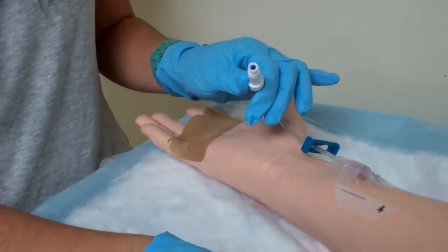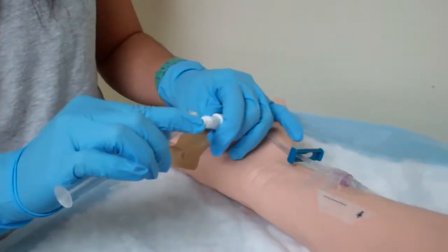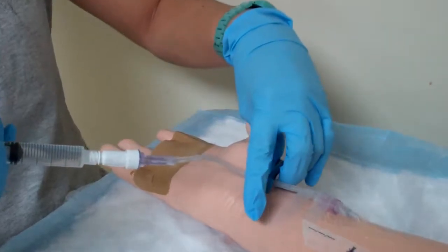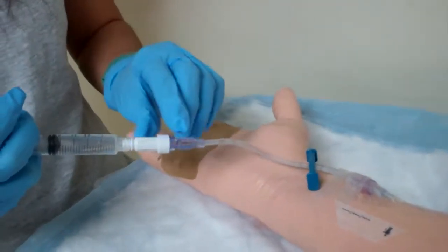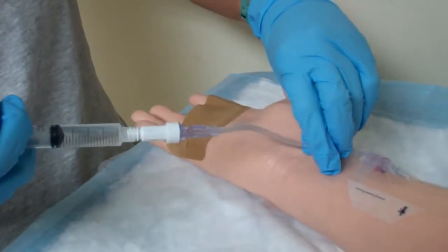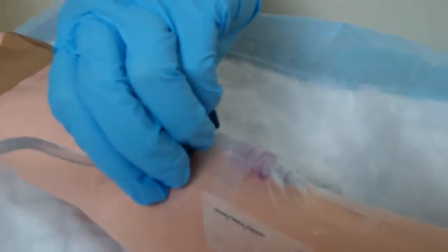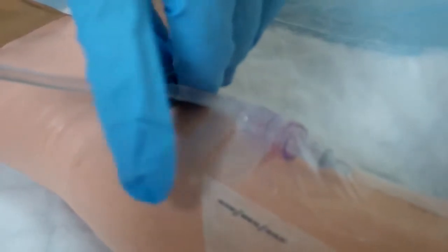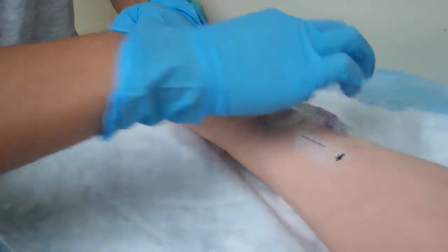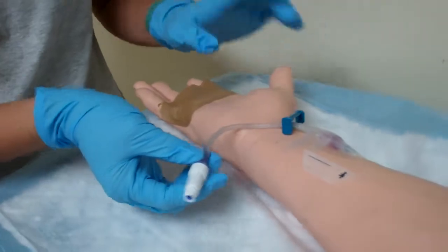Okay, 15 to 20 seconds are up. Take my flush and then I will connect it. Holding pressure, I'm just going to open this and use a push-pause method. So it looks like it's flushing. Close this. And if I felt resistance trying to flush the line, then I would not want to try to force it, because it could mean that there's a clot and I would dislodge the clot.